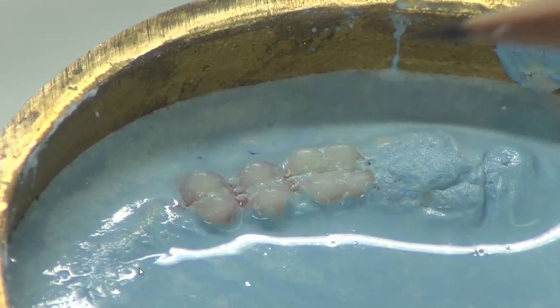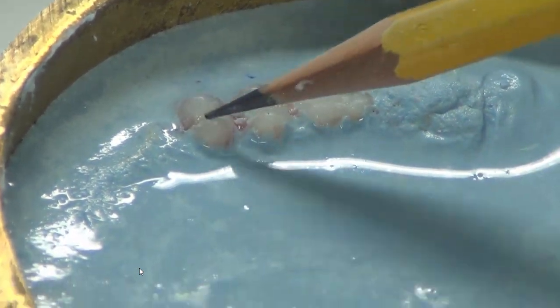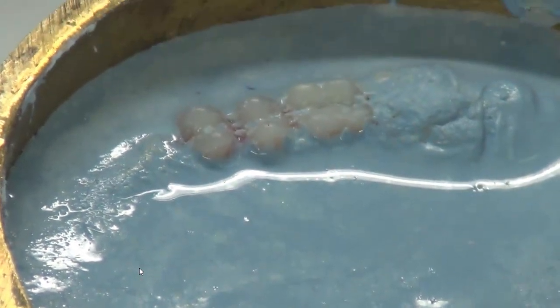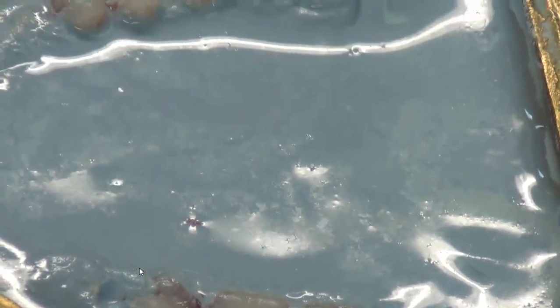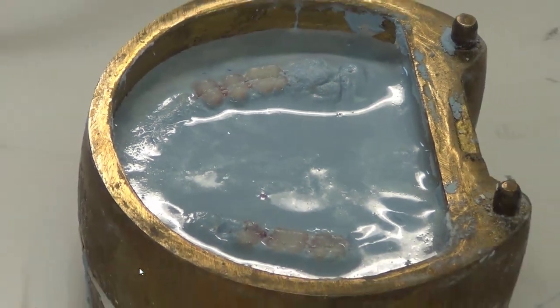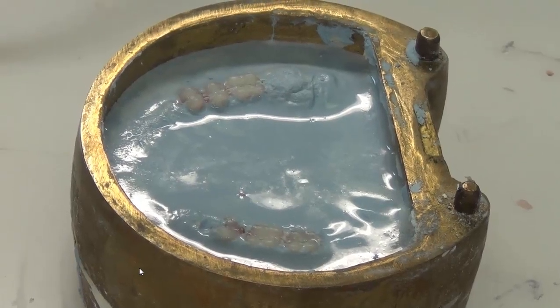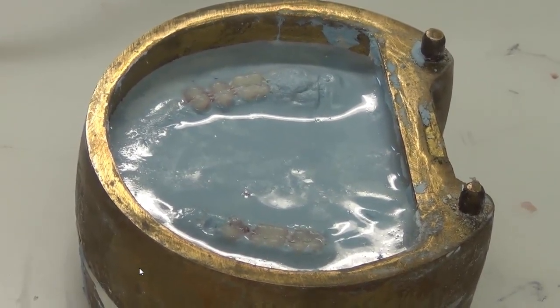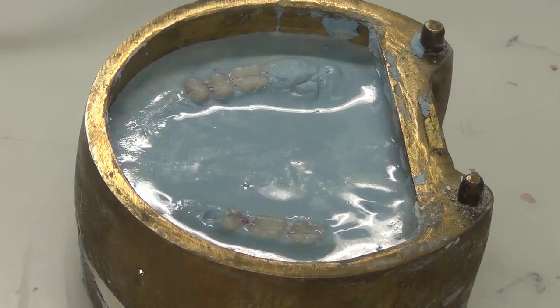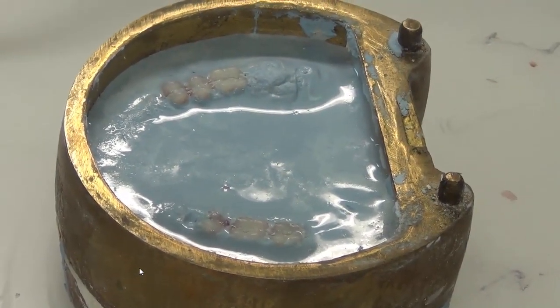We also had added the stone, the first layer of stone, up to the level of the occlusal surface of teeth. We re-expose the acrylic denture teeth. We make sure that they are clean and clear of stone, and we are going to add, also using the vibrating table once more to eliminate bubbles and to increase the adaptation of the added mix, a third layer. The third layer, we call it improved stone.